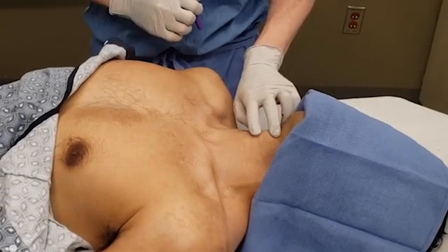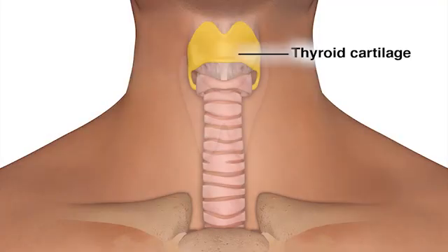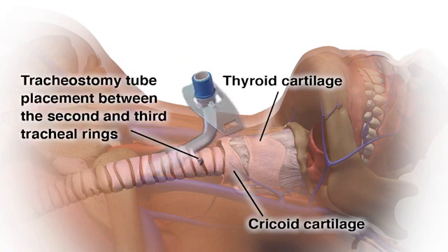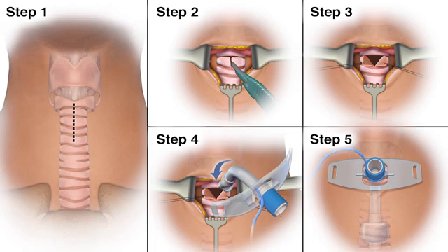Palpate the patient's neck to identify key anatomical landmarks. These include the thyroid cartilage, the cricoid cartilage, and the sternal notch. The ideal location for placement of the tracheostomy tube is between the second and third tracheal rings. Make sure to check for a high-riding innominate artery that may overlie the area of the planned incision. An open tracheostomy should be performed instead if the patient has a high-riding innominate artery.